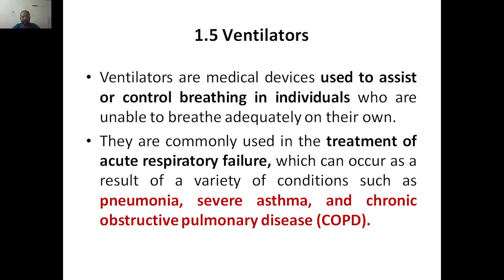Maybe in some cases like accidents where the lung is damaged, or in severe cases of lung disorders like COPD or the chronic disorders associated with the lung, which are very severe disorders that may lead to death. During that time you need the help of ventilators so that they can assist you with the gas exchange mechanism. It will give you the proper breathing mechanism.